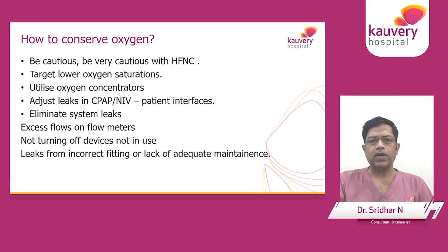So how do we go about conserving oxygen? So be cautious, be extremely cautious with high flow nasal cannula. I have almost completely stopped using high flow nasal cannula in our unit, unless for extremely rare patients where I know that this patient is going to benefit only from high flow nasal cannula. But once again, I try and minimize the usage. The second way is to target much lower oxygen saturations. We'll discuss this in a minute.